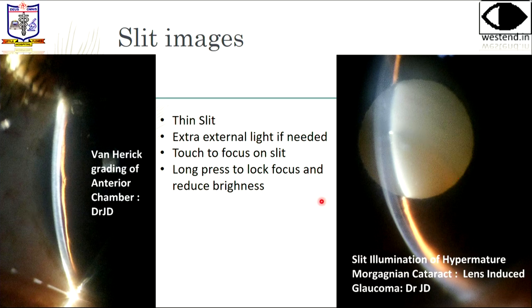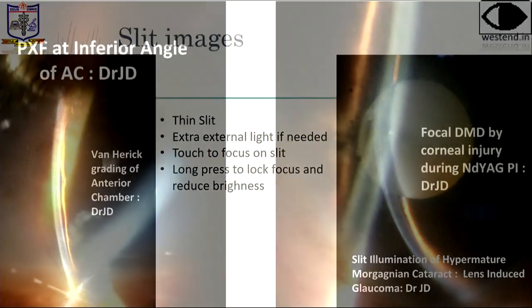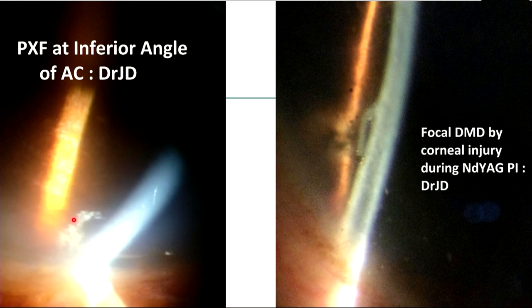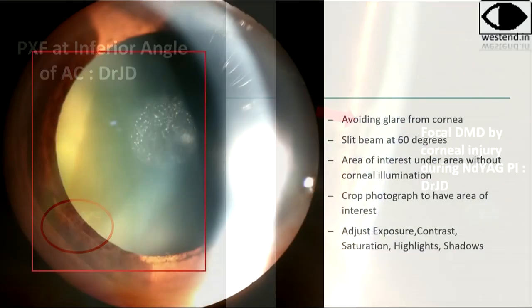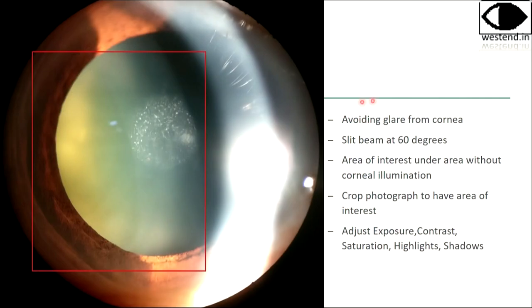Did you see this? This is a sunken nucleus. This is pseudo-exfoliation in the angle — this is a slit image, not a gonioscope image. This is a focal Descemet's membrane detachment at the point of laser PI. This could not be taken by a regular slit lamp camera; it had to be touch-focused and brightness-adjusted. The phone gave better photos here. If you take a photo like this and forget to crop, you can crop it later — you don't need the glare unless you're going for a lens flare effect.